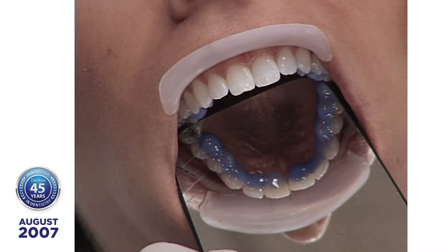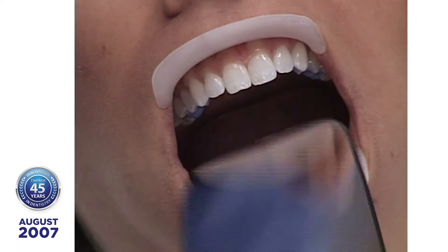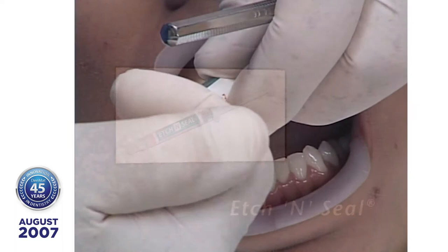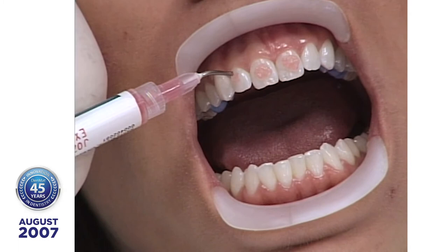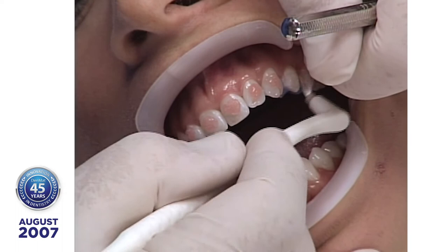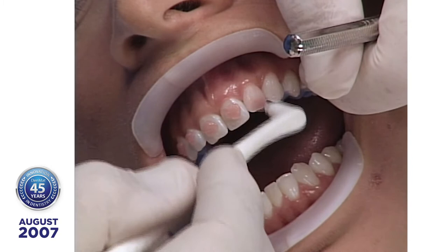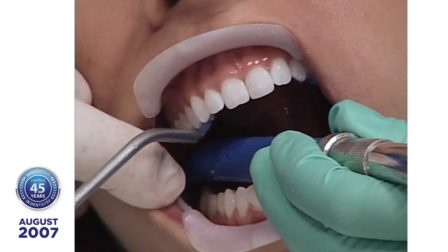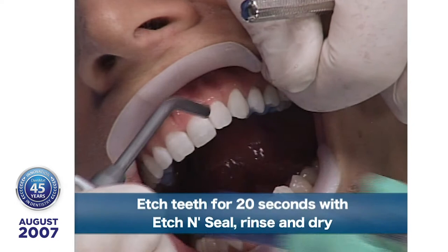Now we're going to start surface preparation on the enamel. I'm going to use etch-and-seal, which is 25–30% phosphoric acid with aluminum oxalate. The purpose of the aluminum oxalate is that if you're working on operative patients with dentin tubules exposed, the aluminum oxalate helps seal them and prevents sensitivity. Now the etch is complete — nice and frosty. We're going to put tenure AB on here. Tenure AB was developed by Dr. Ray Bowen.